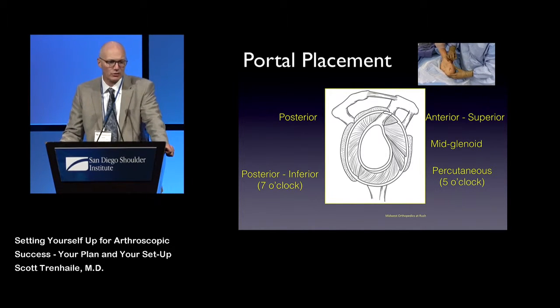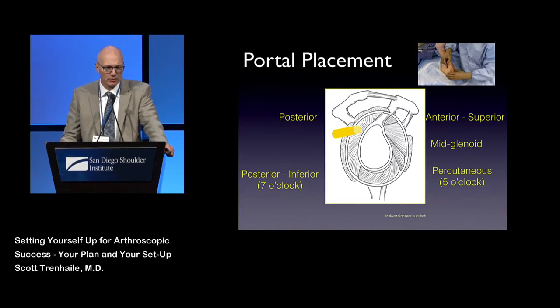Portal placement, we all know about this. Your standard posterior portal along with your mid-glenoid portal, your anterior superior portal.